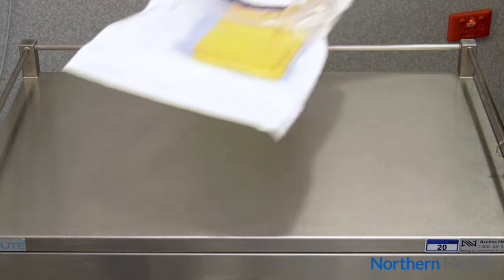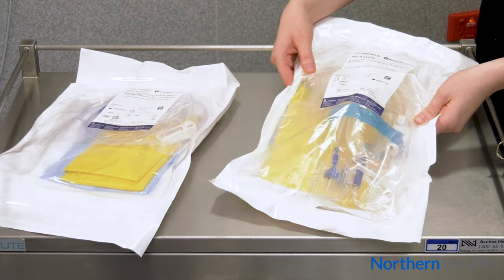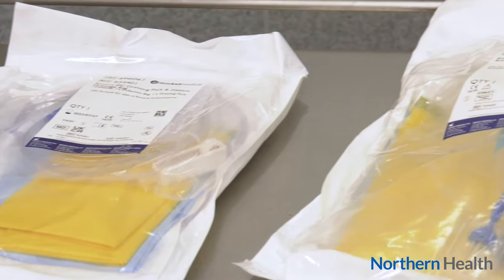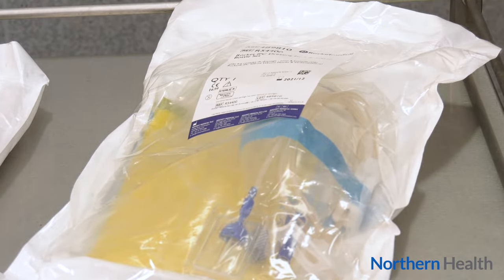The vacuum bottle or bag comes in a drainage kit, which also includes equipment to keep your tube clean and to redress it. There are 5 kits in a box. These kits will be supplied to you by the hospital. If you are running low on kits, call the Pleural phone number to arrange further supplies.